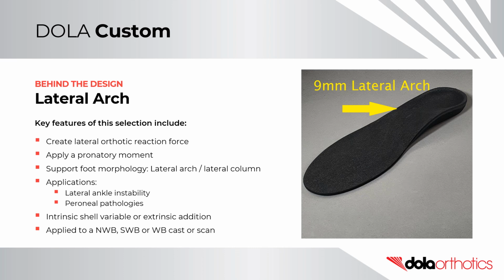It could be either an intrinsic shell variable or extrinsic addition, and can be applied to any scan or cast type, including non-weight bearing, semi-weight bearing, or weight bearing.